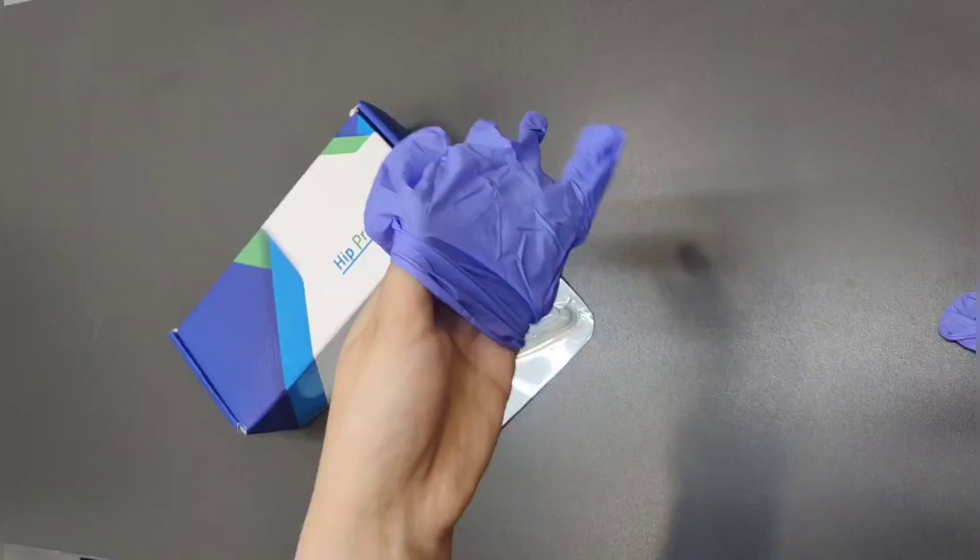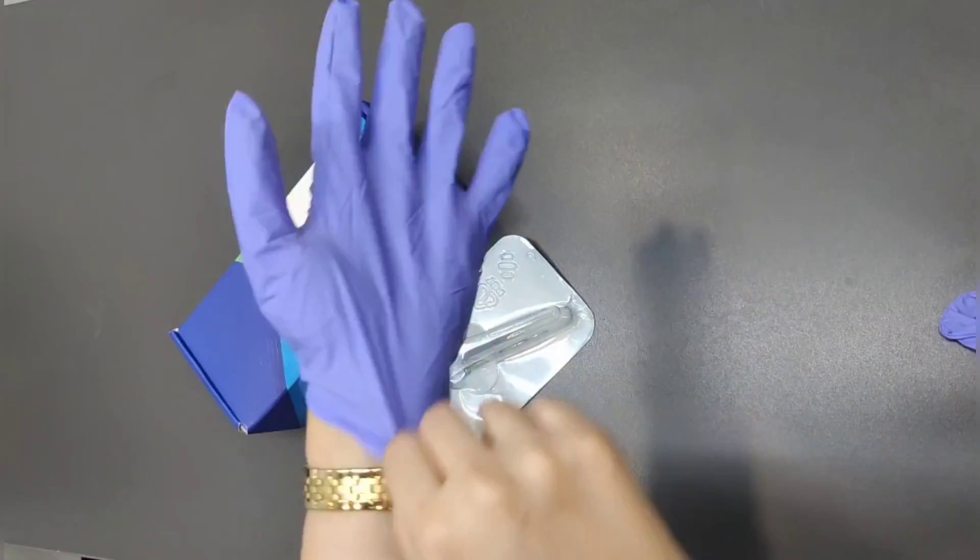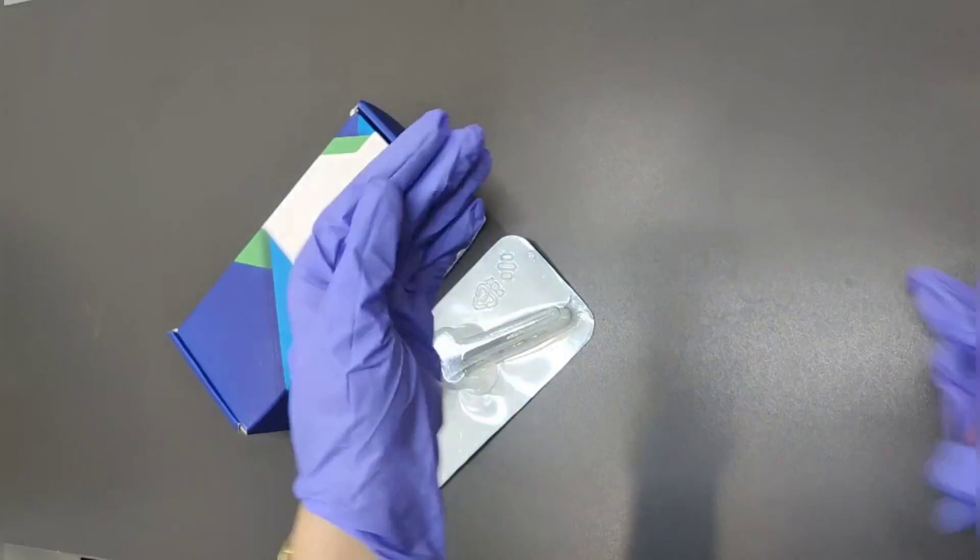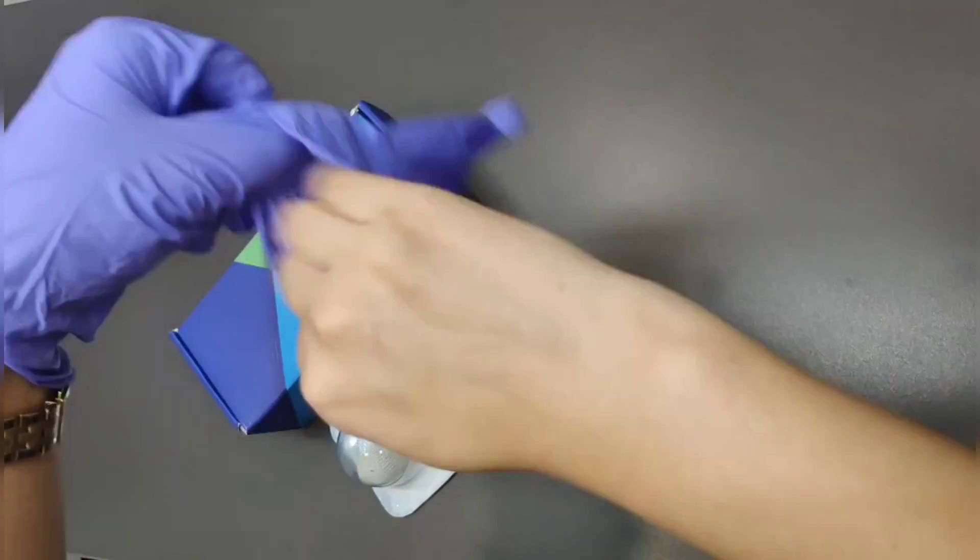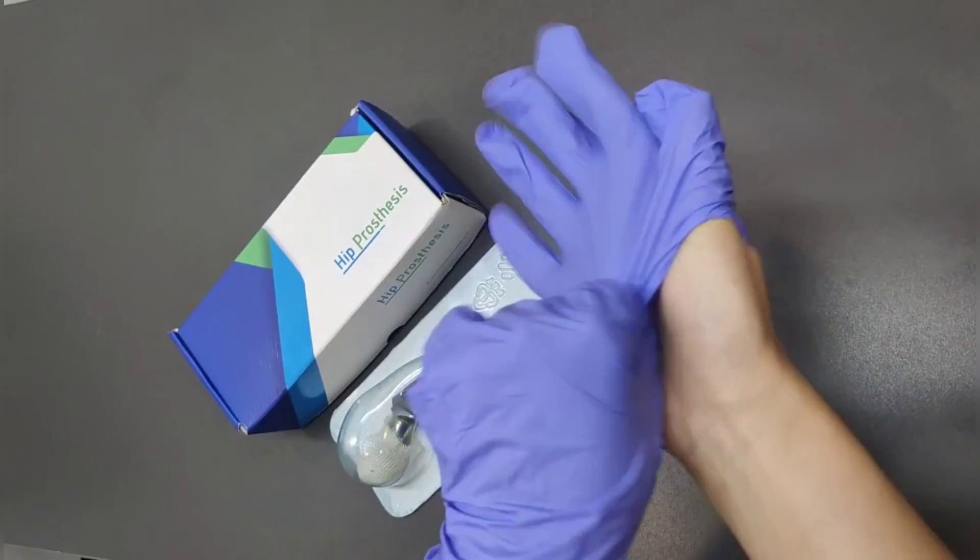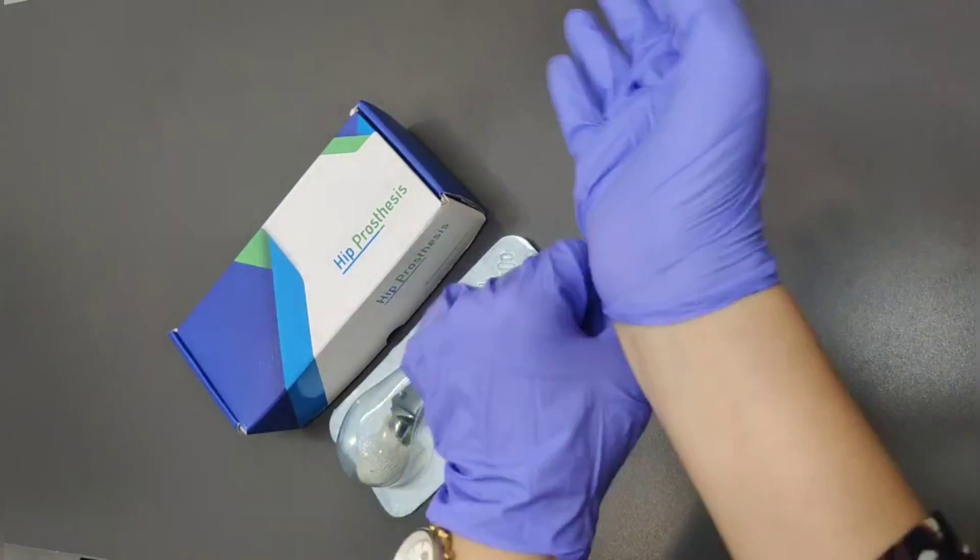Our Bipolar Hip Prosthesis comes in different sizes ranging from 37 mm to 53 mm. This ensures a tailored fit for each patient's unique needs.